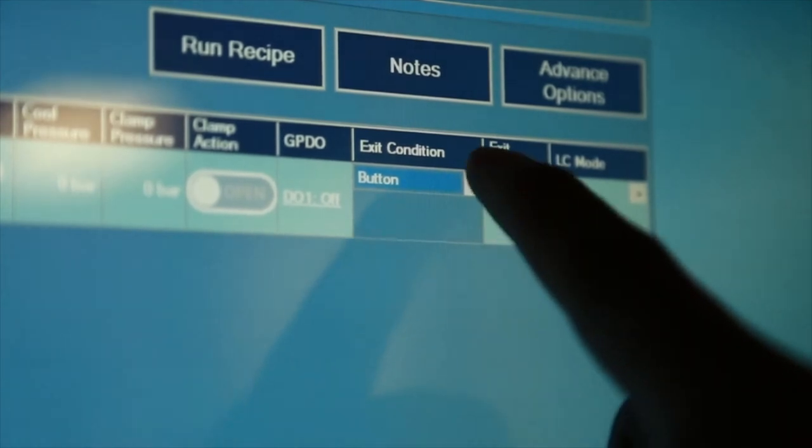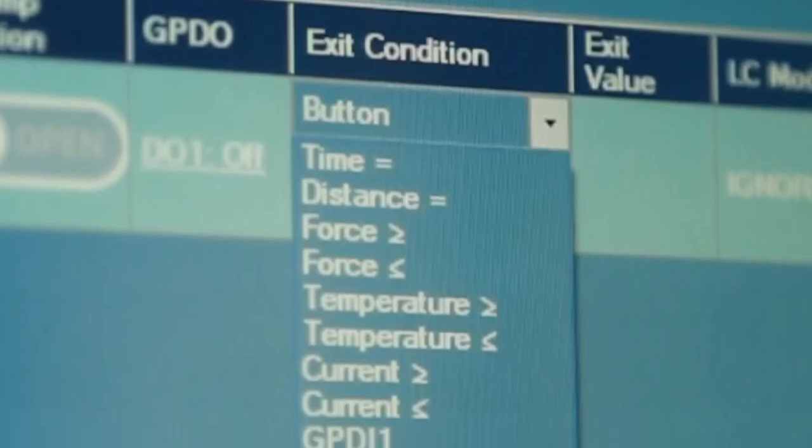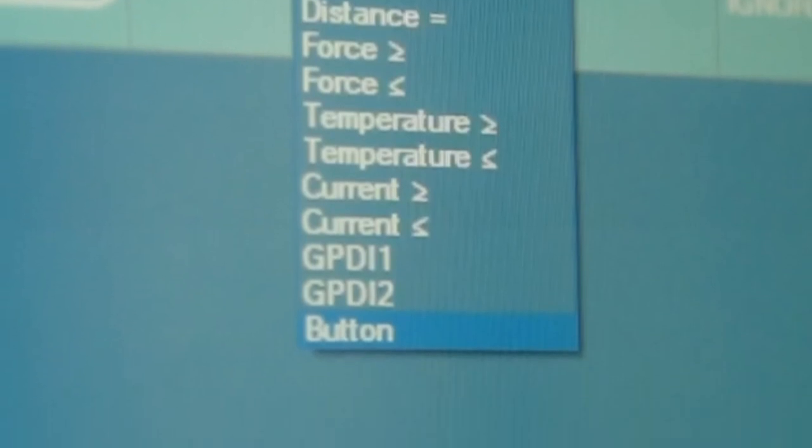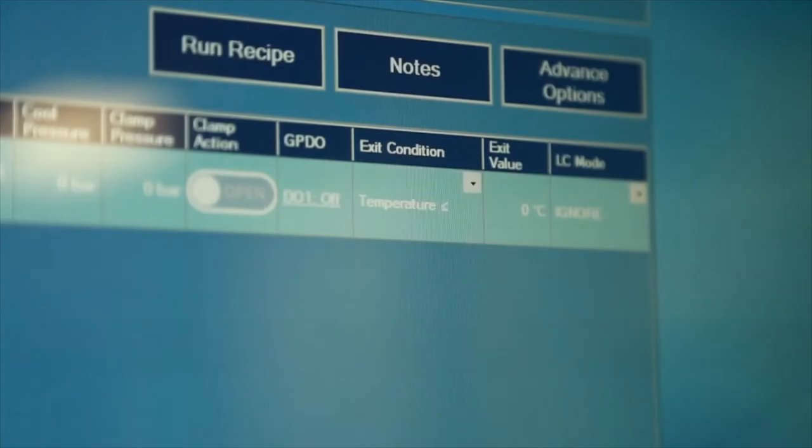Then, choose one exit condition and value based off time, distance, force, temperature, current, digital inputs, or optical touch buttons.